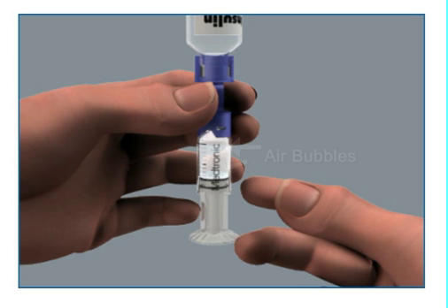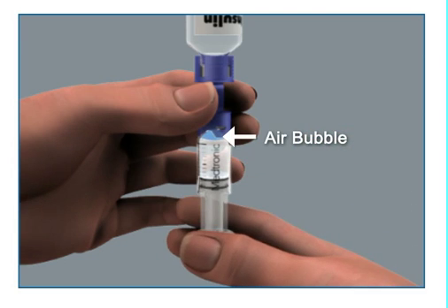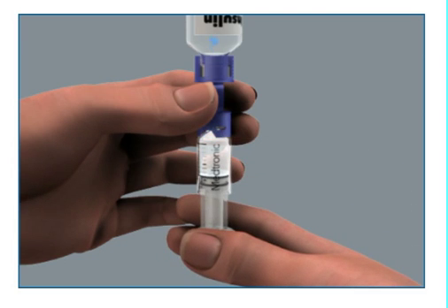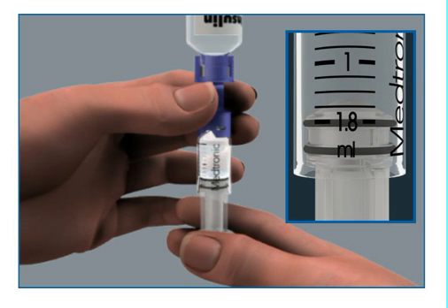Tap the reservoir hard enough to make the air bubbles rise to the top. Slowly push up on the plunger rod to remove the air bubbles, then pull down on the plunger to fill the reservoir to the number of units desired. Repeat as needed until air bubbles are removed.